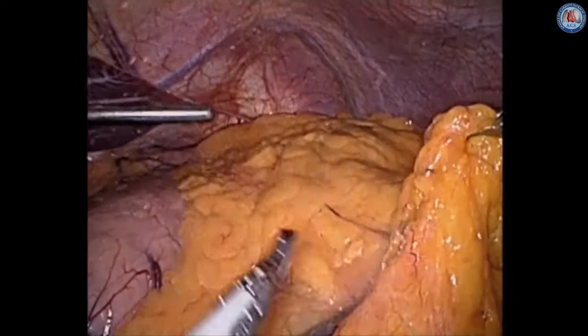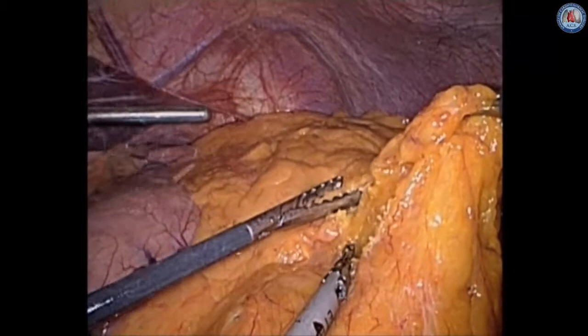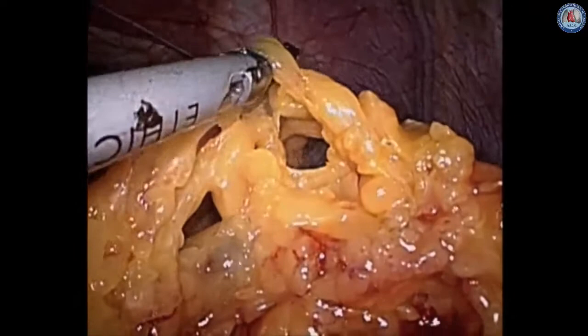Our initial approach begins in the abdomen laparoscopically. We identify the greater curvature and try to keep a fairly large omental skirt that we can later use as our omental patch. We get into the lesser sac laterally and begin to extend this up towards the short gastrics, being careful to note where the gastroepiploic artery is to make sure we stay away from the wall.